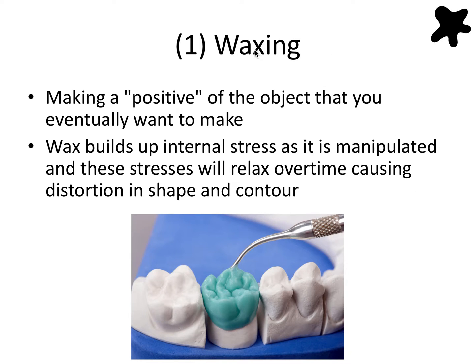Step one, after making the die and ditching it and painting on the die spacer, is waxing. Waxing involves making a positive of the object that you eventually want to make, so we're building the crown on the die out of wax. Wax is a great material because it can be easily manipulated with hot and cold instruments and keeps its form when you're done. Waxing teeth is often one of the first things dental students do in the sim lab — dreaded at first but can become quite enjoyable after some practice.